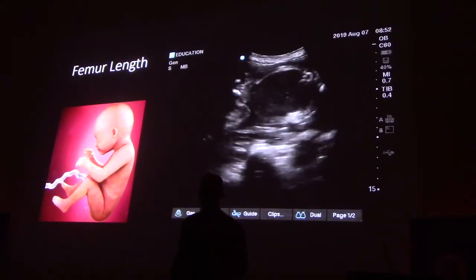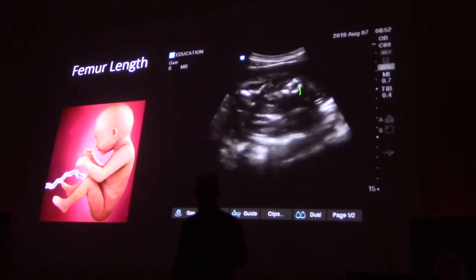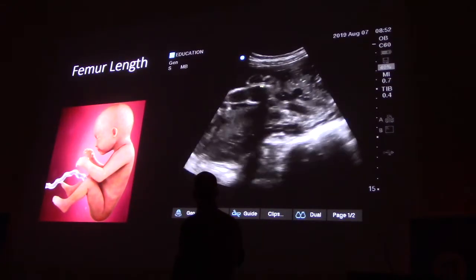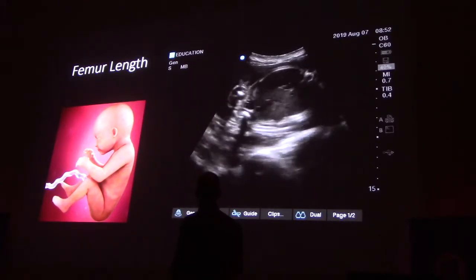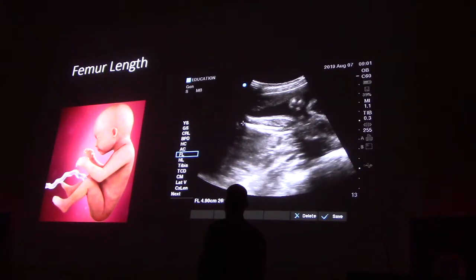So that's one. I'm going to do it one more time, just because I think this is actually useful. So abdomen, pelvic bone, femur coming off of here. And then you just follow these. And then once you kind of know the general trajectory, this is what you get. This is the same patient. This is one of the next clips.